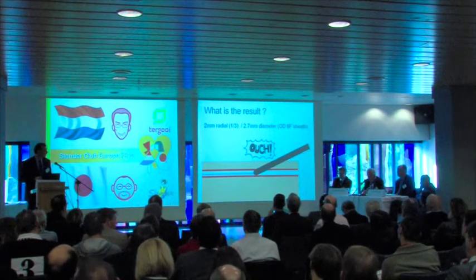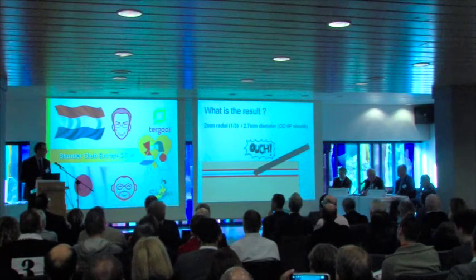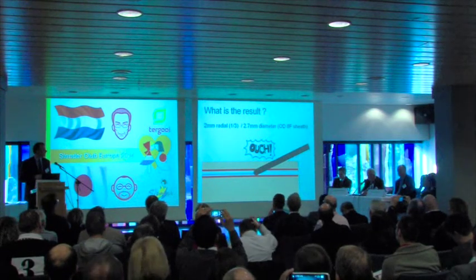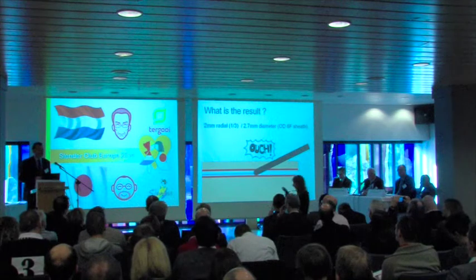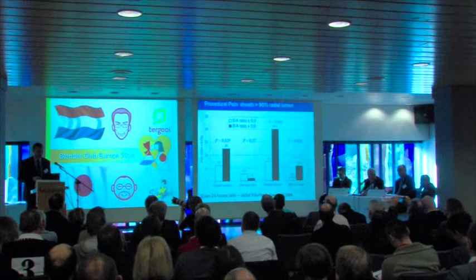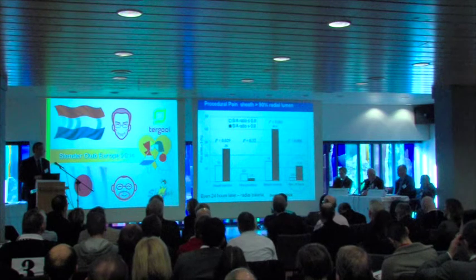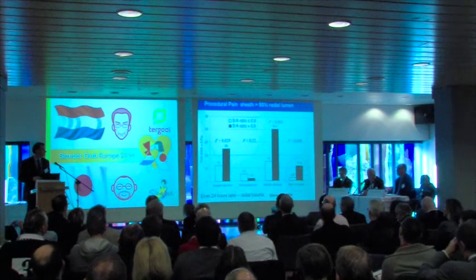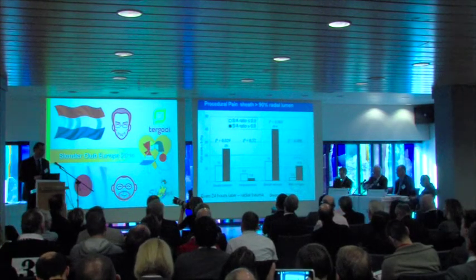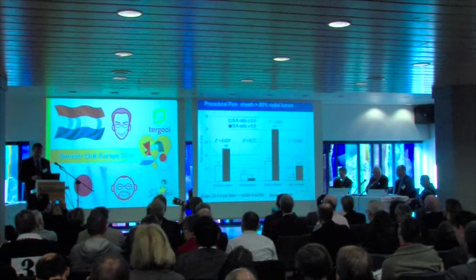So what happens when we put in a sheath that's larger than the radial artery lumen? Well, we do a lot, in our centre certainly, to give our patients sedation and make them feel comfortable. But there's no doubt that when we insert a radial artery sheath that's larger than the lumen, we're causing trauma and we're causing pain to that radial artery. You can see here that when we use a sheath that's larger than the radial artery lumen, we even have persistent pain after 24 hours. So we're causing sustained damage to the radial artery that's causing persistent pain, not only at the time of the procedure, but even 24 hours later.